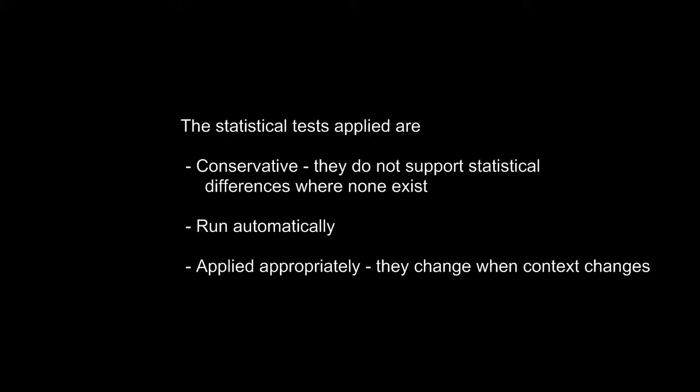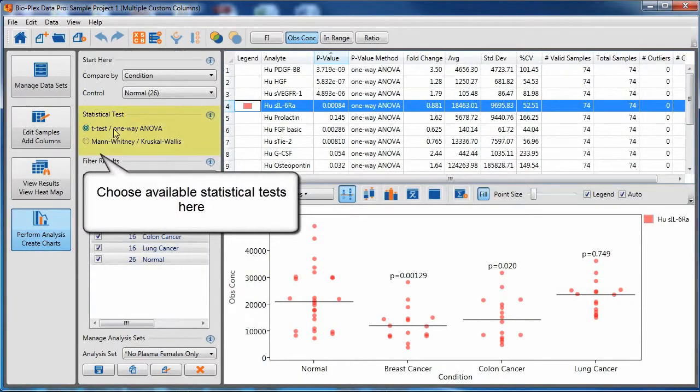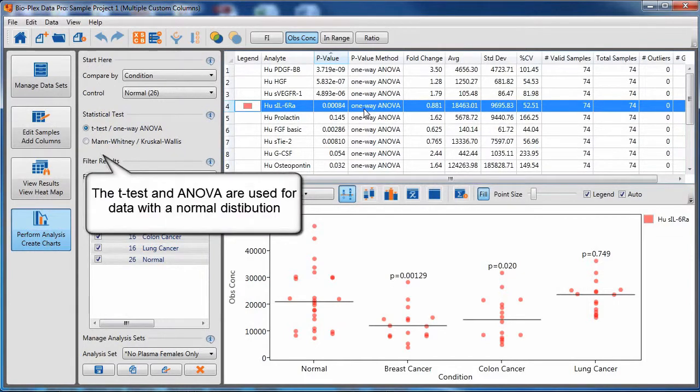The statistical tests applied are conservative. They will not support statistical differences where none exist. They run automatically and they are applied appropriately for the given context. Choose available statistical tests with the controls on the left.